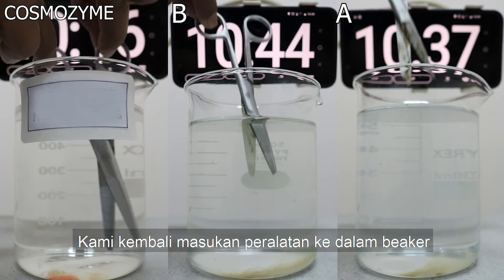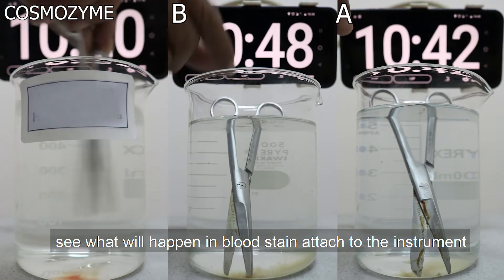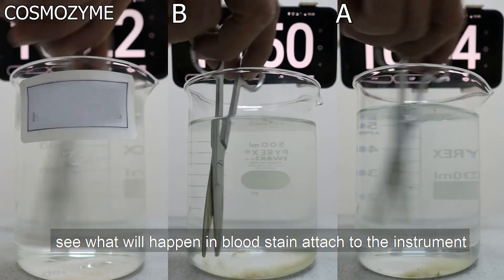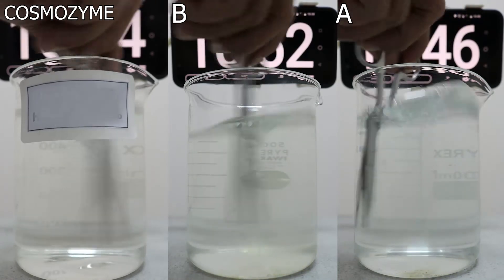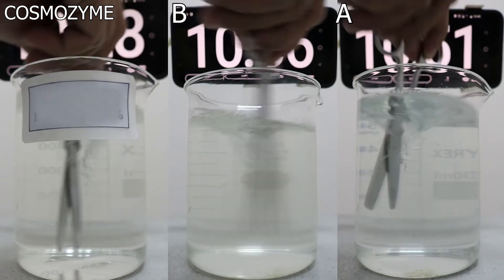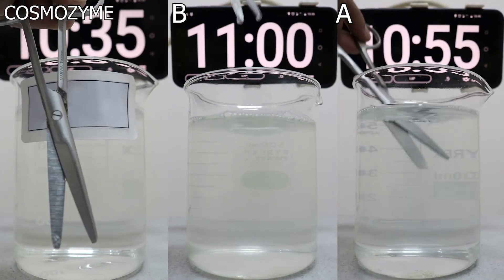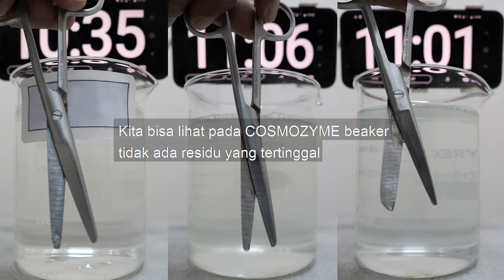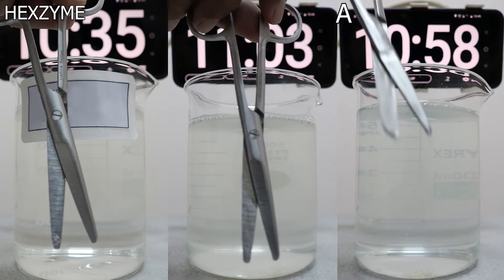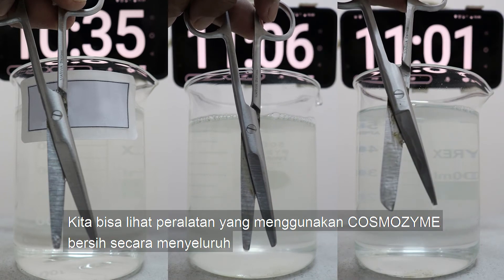We will put the instrument back into the solution and stir it. See what happens to the blood stain attached to the instrument. We can see in the Cosmozyme beaker there is no residue left at the bottom. And we can see the instrument using Cosmozyme is perfectly clean.